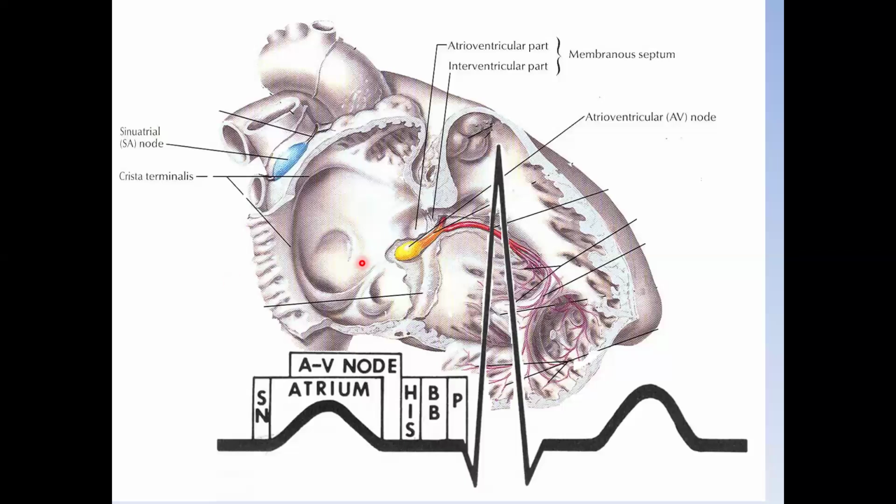If we take the heart again, as you can see, this is the P wave, and this is the PR interval, which is the isoelectric line. AV node conduction actually starts pretty early on, when the P wave is just forming. The early part of the isoelectric line is through AV node conduction. And then, when it is a silent flat line, conduction is through the His bundle, bundle branches, and Purkinje fibers. And once it reaches the myocardium, then we start seeing the electrical signal again.